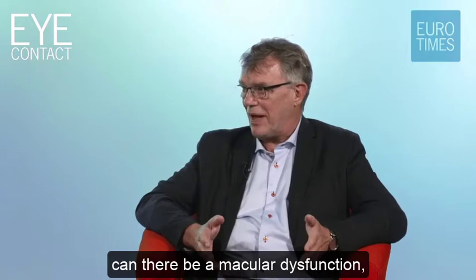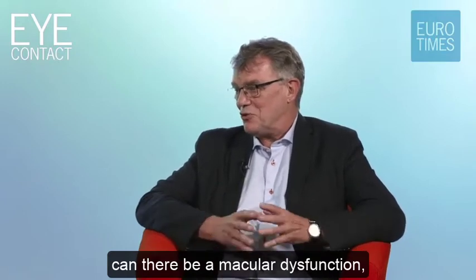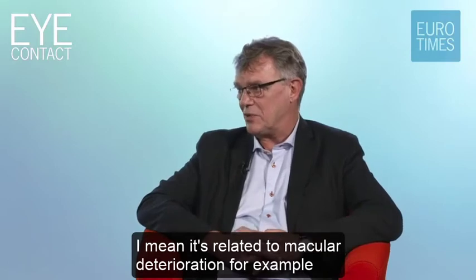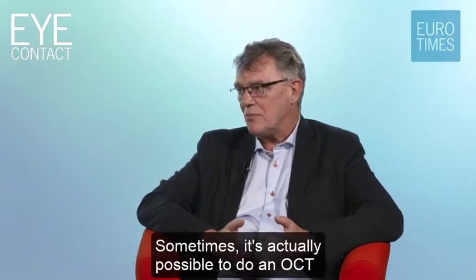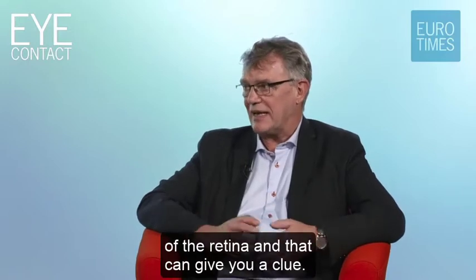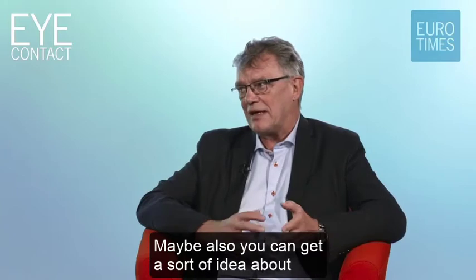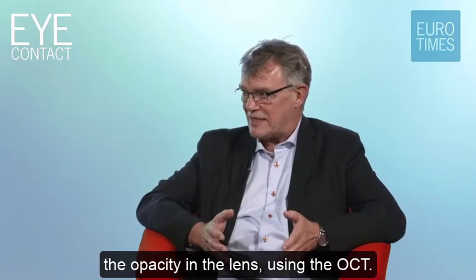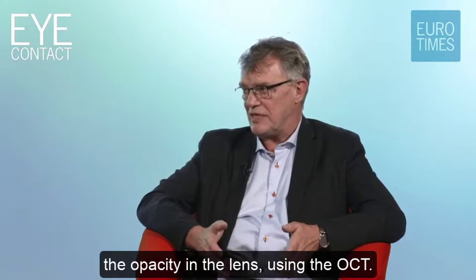Can there be a macular dysfunction, age-related macular degeneration, for example, or other things? Sometimes it's actually possible to do an OCT of the retina, and that can give you a clue. Maybe you can also get an idea about the opacity in the lens using your OCT.